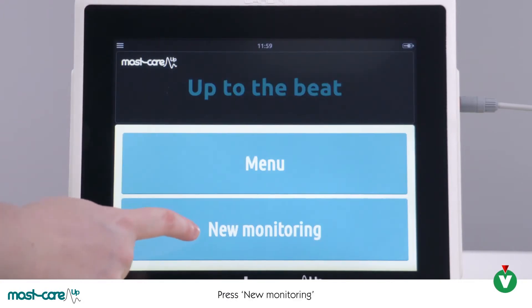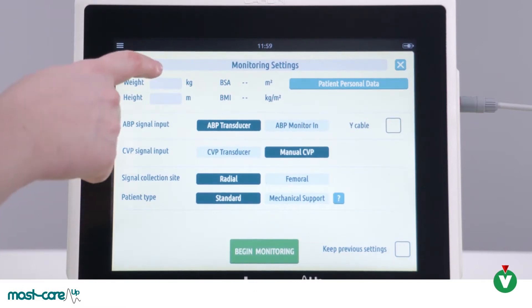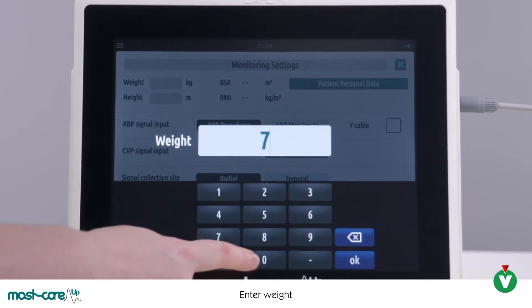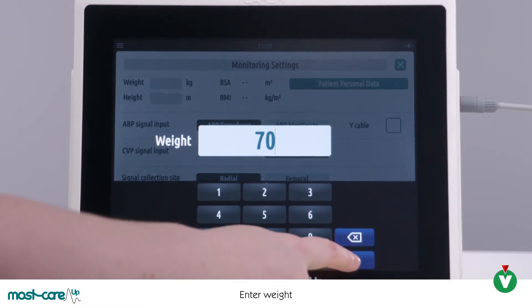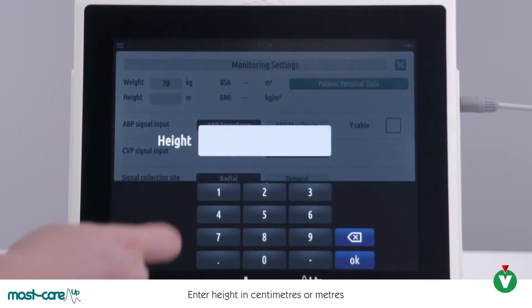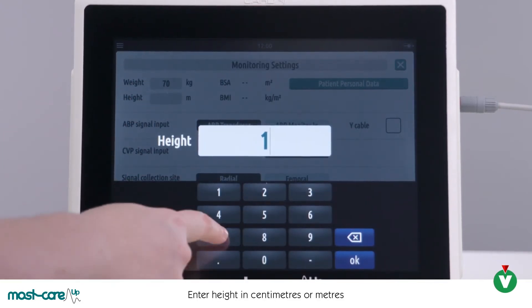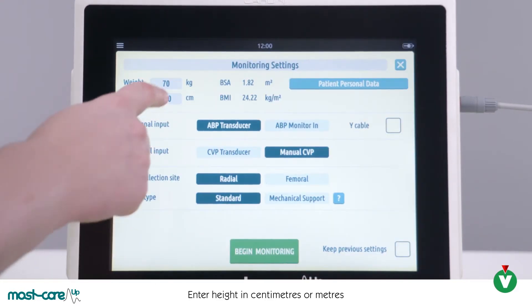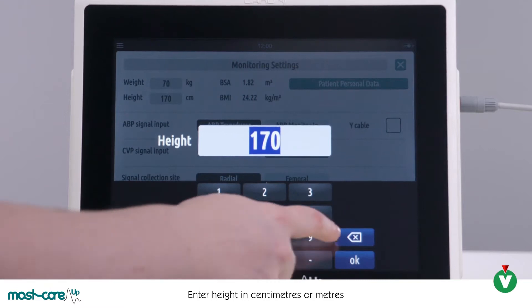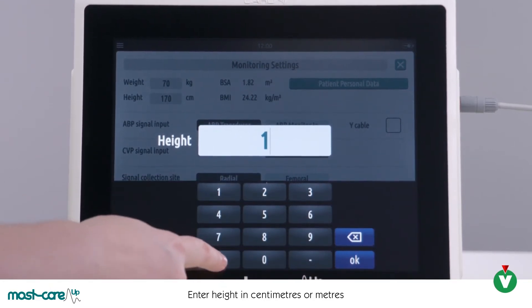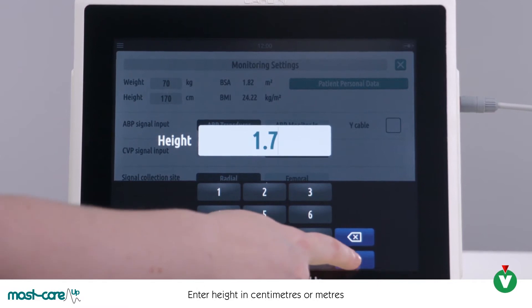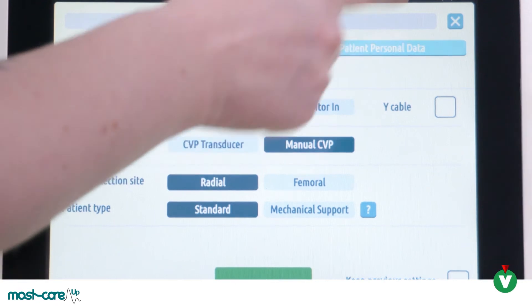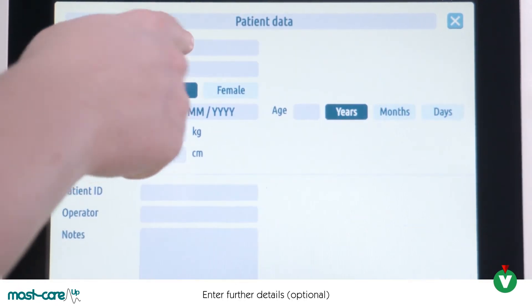Press New Monitoring. Input weight in kilograms, then input the patient's height in meters or centimeters — this changes automatically. You do not need to input the patient's personal data for the monitor to work; these details are optional.